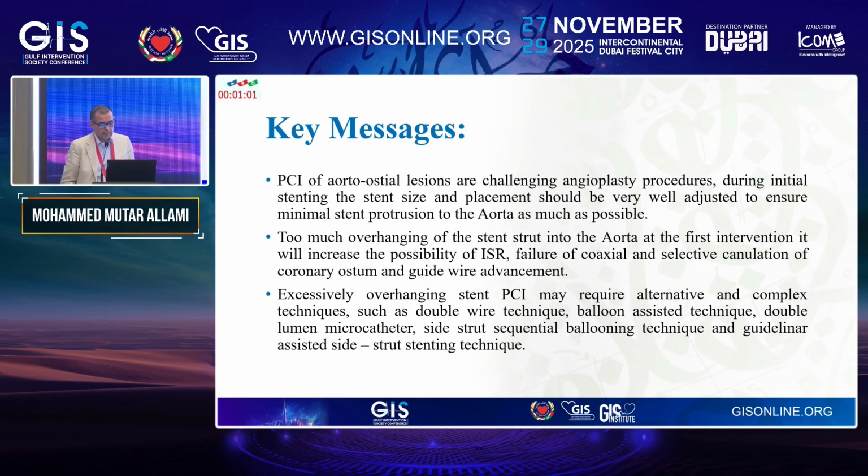Excessively overhanging stent PCI may require alternative and complex techniques such as double wire technique, balloon assisted technique, double lumen microcatheters, side strut sequential balloon technique, and guide liner assisted side strut stenting technique. And thank you very much.